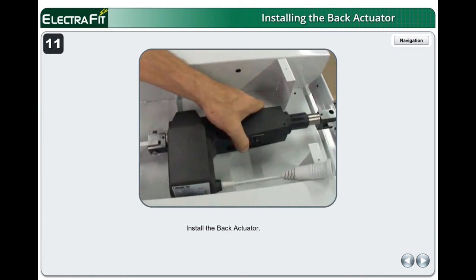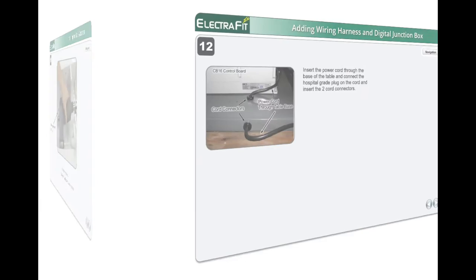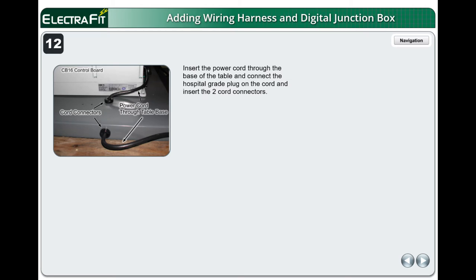Install the Back Actuator. Note the placement of the clevis. Only insert the back end clevis at this time. Insert the power cord through the base of the table, connect the hospital-grade plug on the cord, and insert the two cord connectors. Leave approximately 15 inches of power cord inside the table.